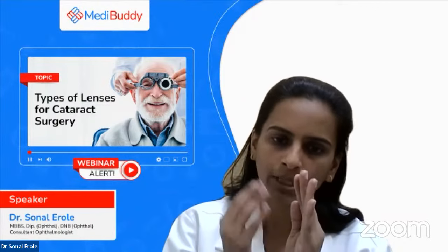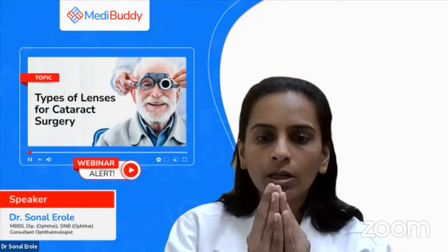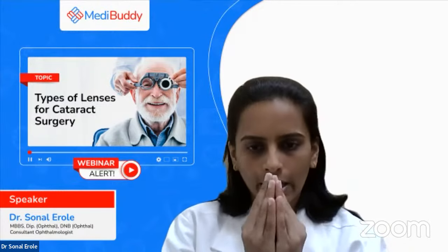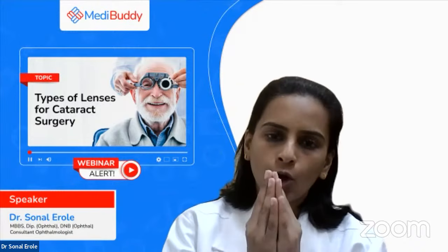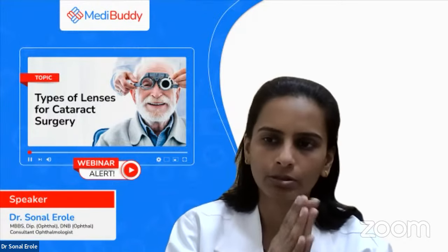So we can remove that lens and put in a new lens. It is not that a 30-year-old cannot have a cataract. They can have one, and we can operate and put very good lenses for these patients.